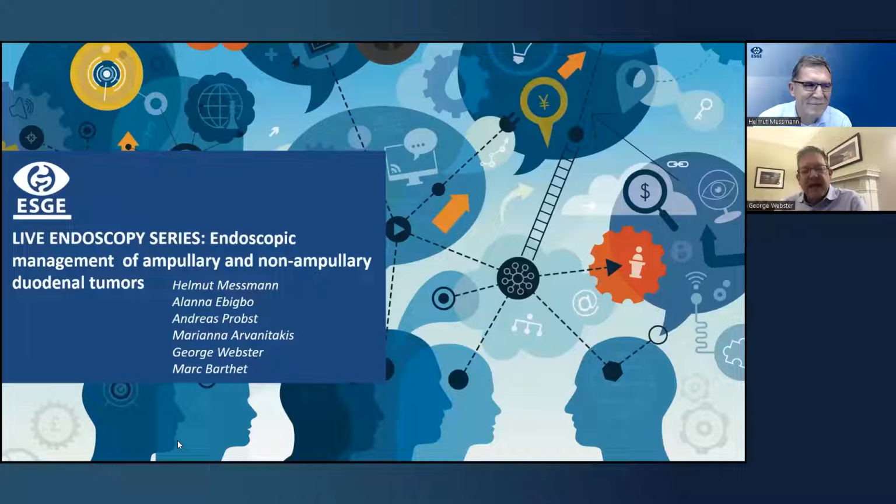Great. No, Helmut, I think this is a great and exciting innovation, and I see we've got several hundred people attending already. And I think there's a reason for that. We've chosen a topic that on the face of it, for the opening topic, is a little bit unusual, but it's not that unusual because all of us in our practices doing diagnostic gastroscopy, we come across duodenal lesions not that uncommonly.